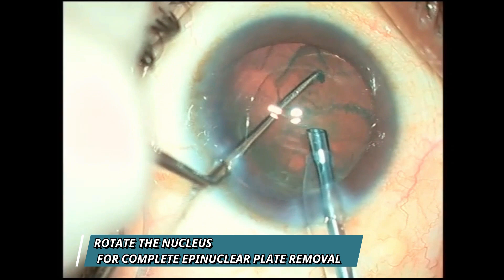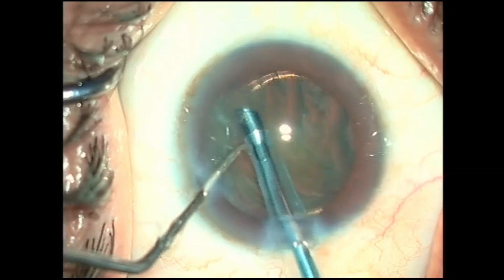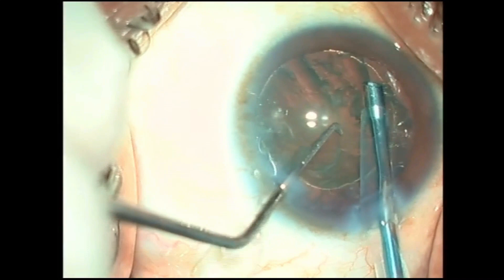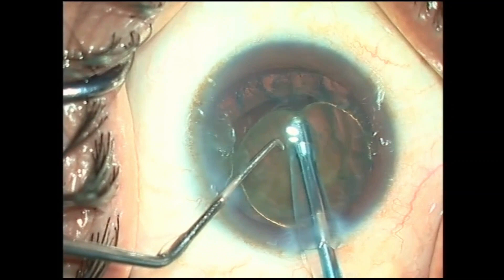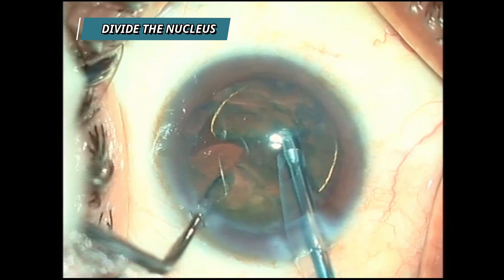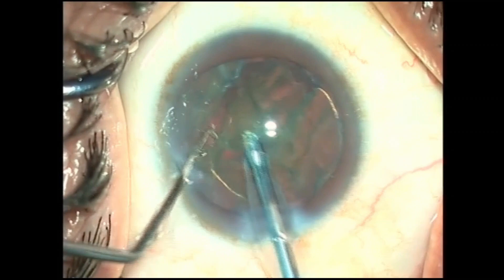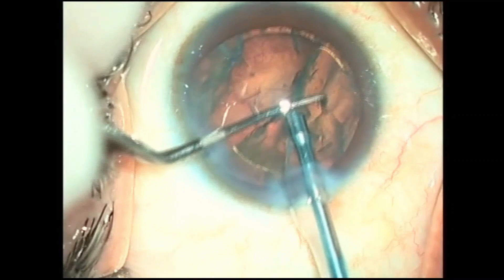Once that is achieved, we remove the rest of the epinucleus by rotating the nucleus to remove the full 360 degrees of the epinuclear plate — using only suction, no phaco energy. After epinuclear plate removal, make a trench in the nucleus and divide it into two, like a normal stop-and-chop technique. The tip remains in the central safe zone throughout. See how easily the nucleus prolapses into the central safe zone, where it can be emulsified and aspirated with minimal phaco energy and mainly suction.